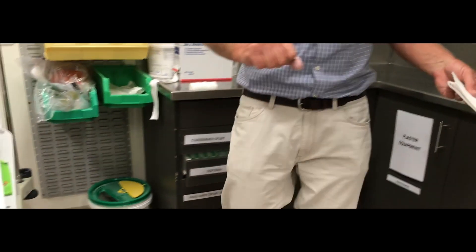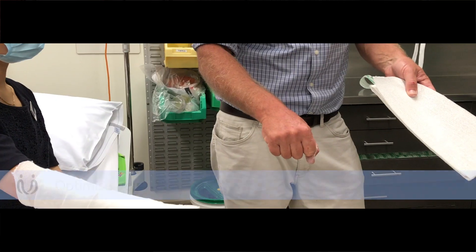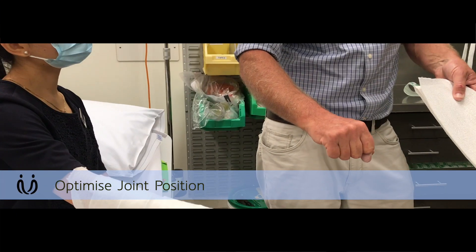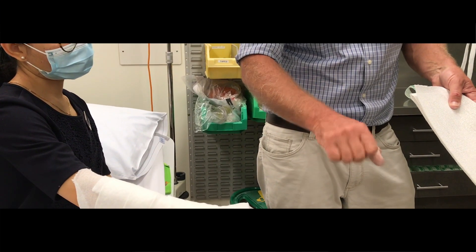When you're putting on a Colles', you want it in pretty much a neutral position. You certainly don't want it really ulnar deviated or really flexed — too uncomfortable for the patient. Pretty much neutral, maybe a tiny bit ulnar deviation, a tiny bit of flexion.